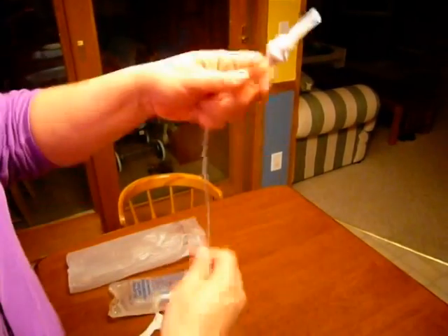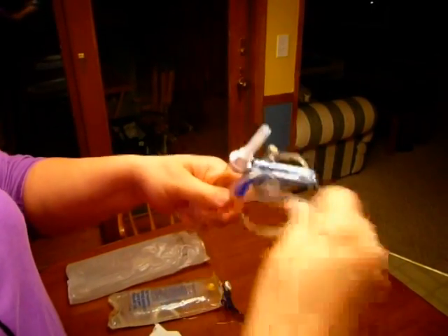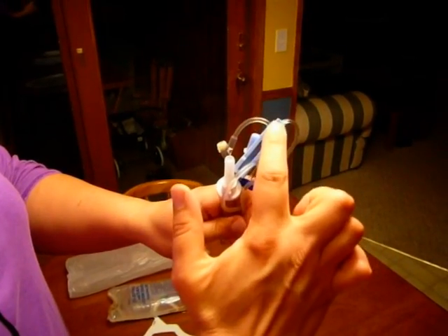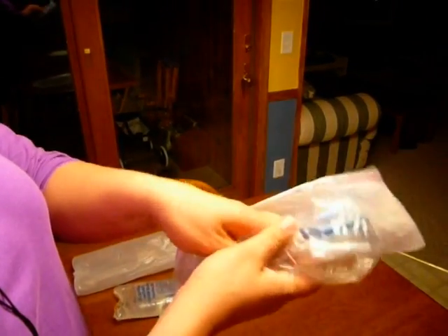Now the last thing you can do is rewind up your tubing like it was in the container, and the only thing that's going to be different about this when you reprime your tubing is that there's already some fluid in there, so it's going to drip right from the get-go, and your roller clamp will start in the off position. Remember that when you open new tubing, the roller clamp is always in the open position when it was sterilized at the company.